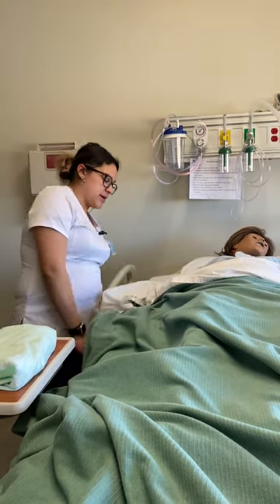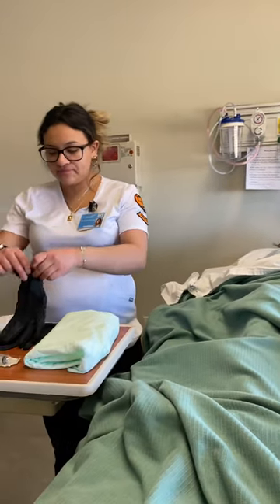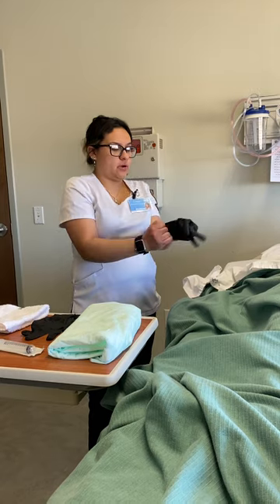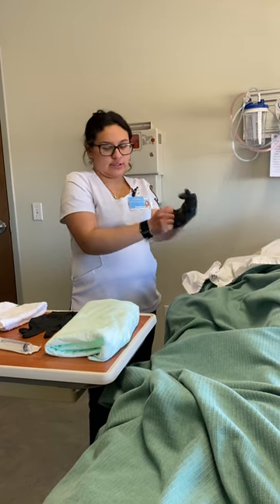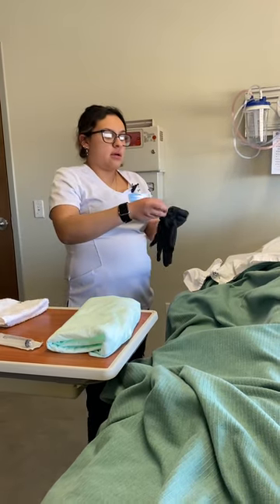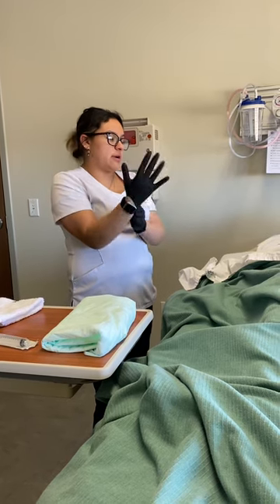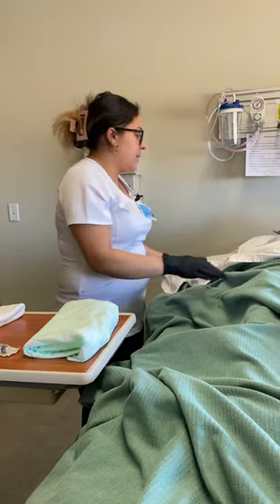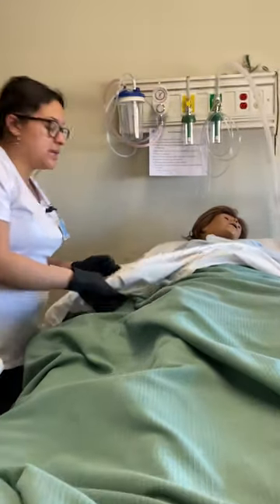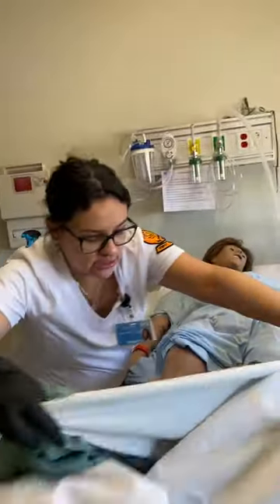I'm going to lower this side rail and go ahead and sanitize my hands, then put on my gloves. I'm going to go ahead and pull the patient curtain around the patient and I'm going to go ahead and peel the covers off. Is that okay? Yes.